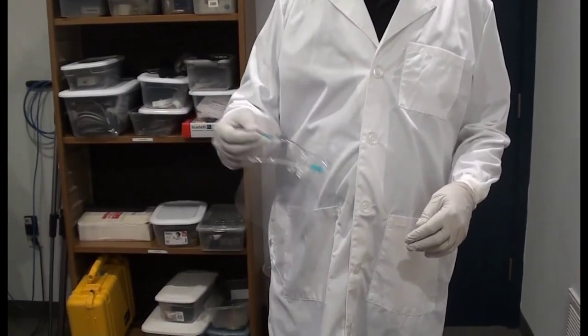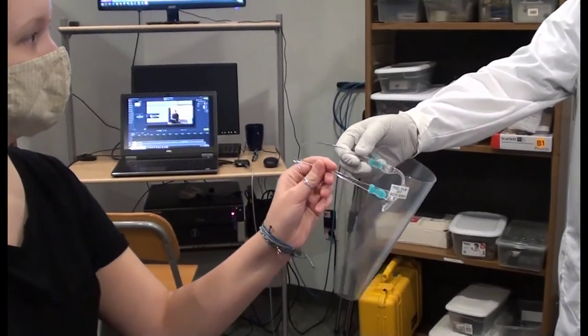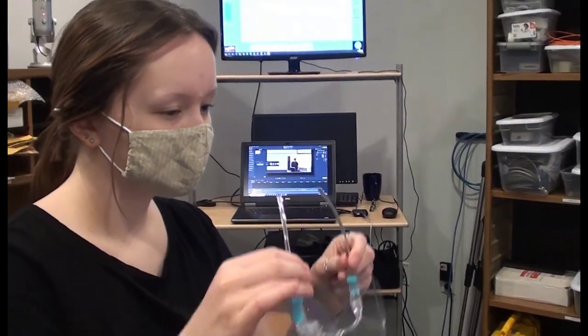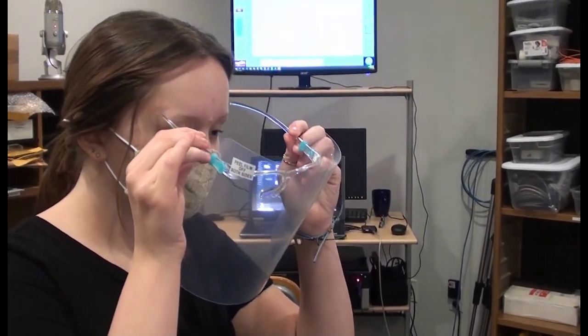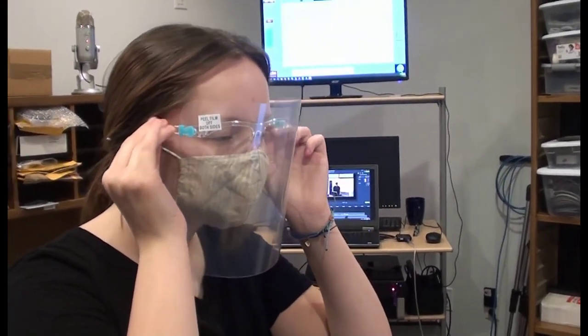PPE for participants will vary from one lab to another. Whether to use anything beyond a face mask is fully up to you. You will see in the steps that follow, the face shield can get in the way of putting the cap on and measuring the head, raising the question of whether to offer it at all, and if so, when to offer it.